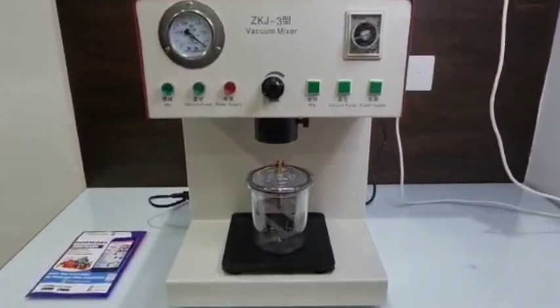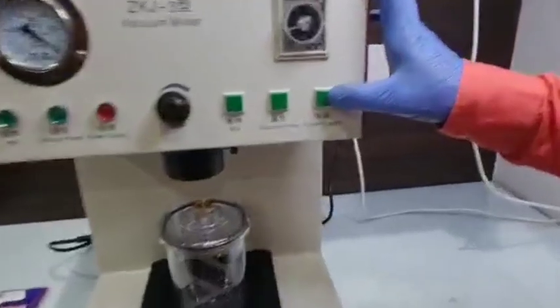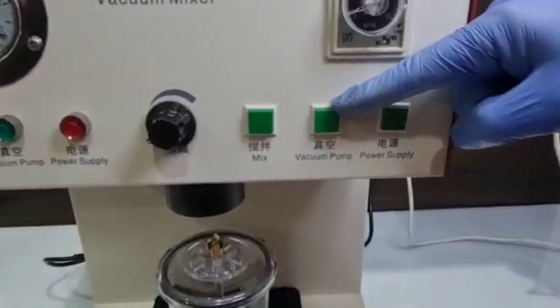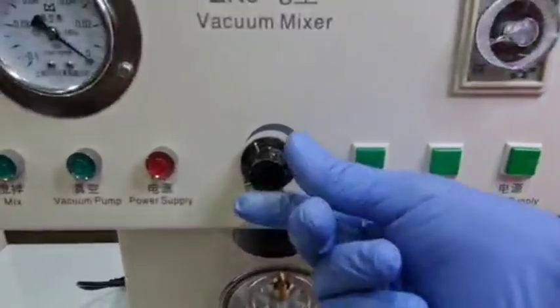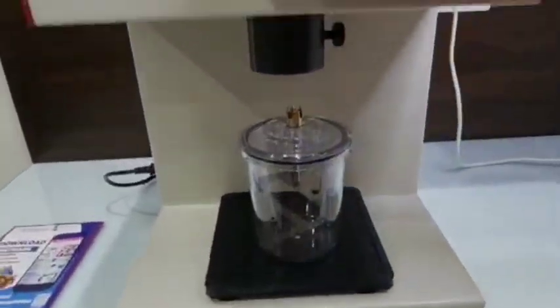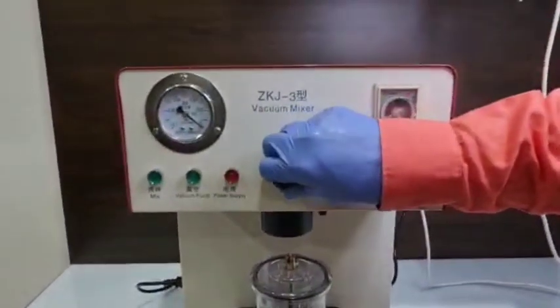The various parts of this machinery are: there is a power supply button — you can see these three buttons — power supply, then there is a vacuum pump button, and then there is a mixer button. In the middle there is a black knob which is used to control the strength of the vibration. You can increase the strength of the vibration with the help of this knob.